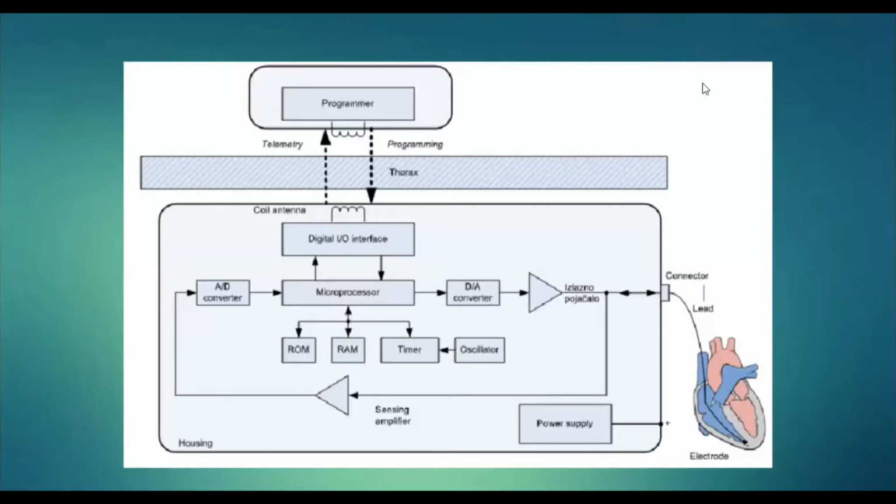And this is the schematic representation of a pacemaker, and I'm going to explain the function of the components. We have the output circuit here, and it contains the output section and voltage multipliers. Multiple capacitors can be used to achieve the desired output voltage. And we have a sensing circuit also, and this circuit filters unwanted frequencies. The processed signal is compared with a reference voltage to determine if the signal exceeds a threshold detection level or not.